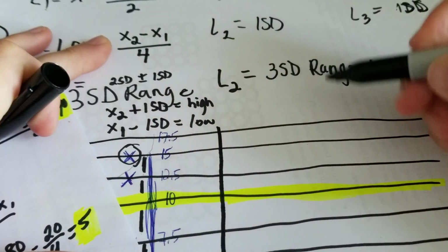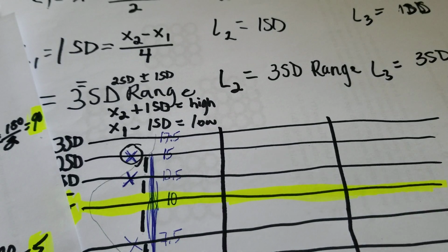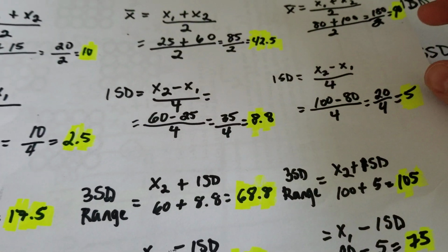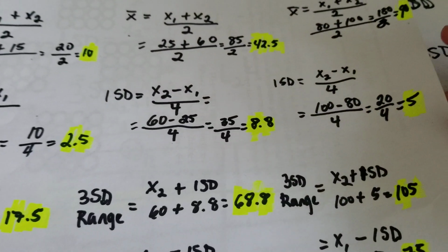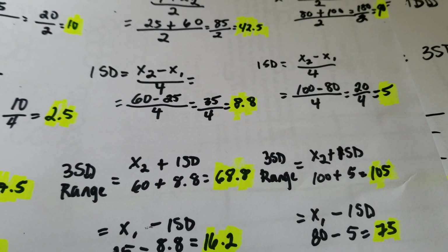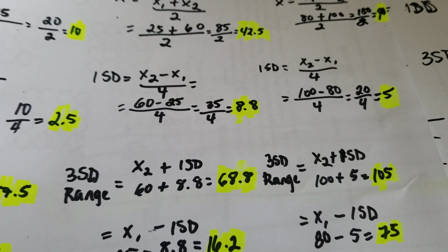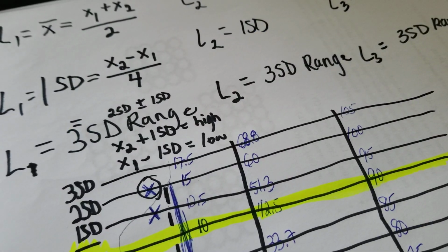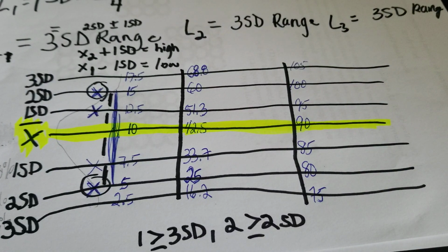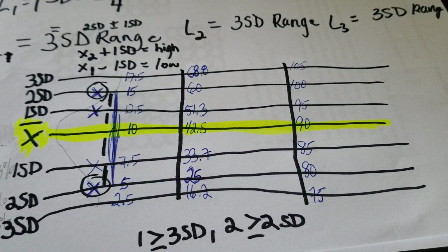That's level 1. Okay, level 2 is going to be plotted in the middle so that when we do our run of QC, we can figure out if we have it out or in. So I'm going to plot these off camera, but here they are. And if you're practicing along with me, go ahead and plot them. You can just pause it here. Okay, so now I have plotted all of them. Check your answers to make sure that you got the same thing. Check your lines. All right. You can pause it here to do that.